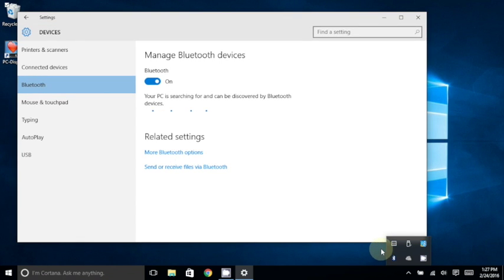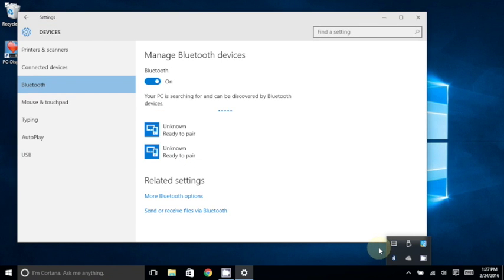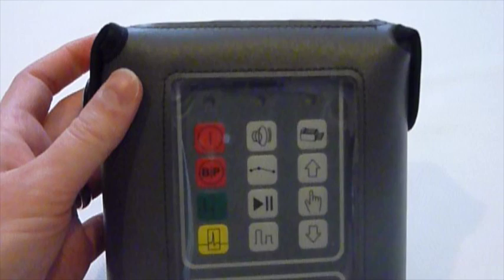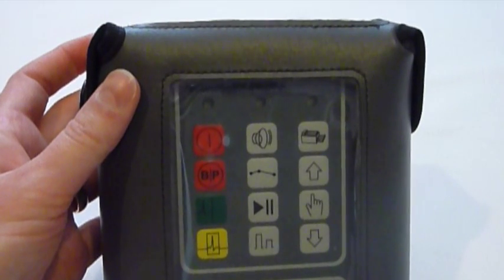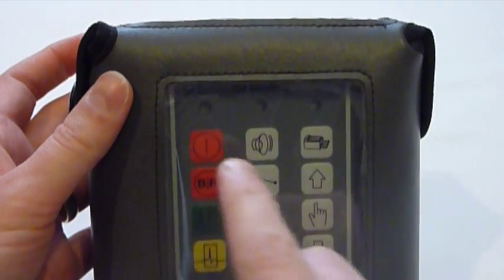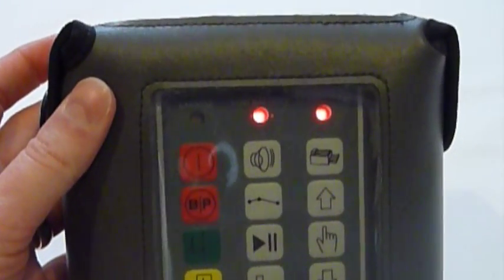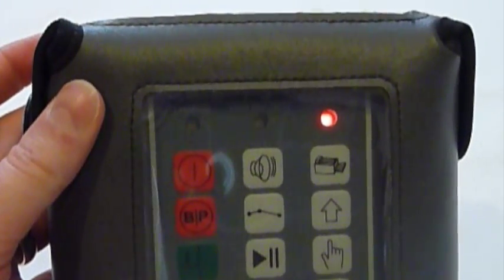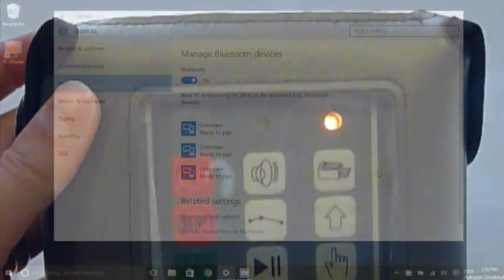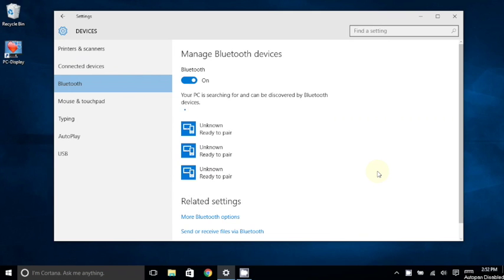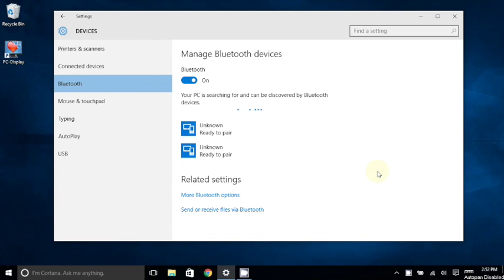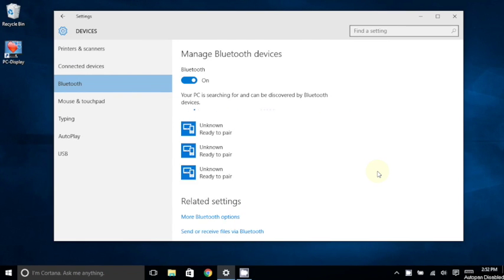This should bring up the Manage Bluetooth Devices section of the Settings window. At this time, you should press and release the Power button on your VMED wireless remote to turn it on. The Manage Bluetooth Devices window should show that it is already searching for available Bluetooth devices. Once it finds your VMED remote, you will select it here.